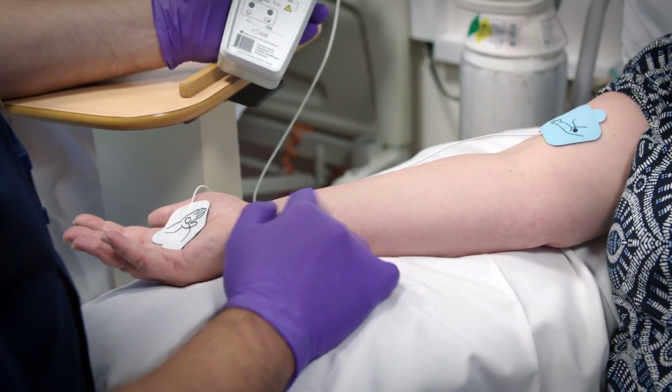Well, there's often been quite a few problems with my veins, and when I've had to have cannulas put in before, sometimes the member of staff's had to leave the tourniquet on for longer. It's been uncomfortable, and I have to be honest and say that sometimes they haven't always been able to access my veins at the first attempt, so obviously it can sometimes be a little bit traumatic.